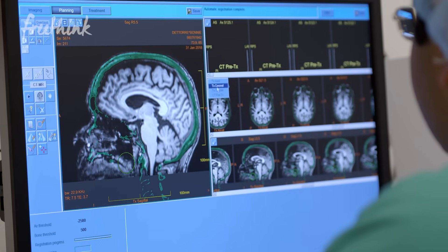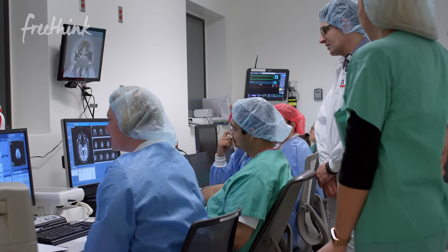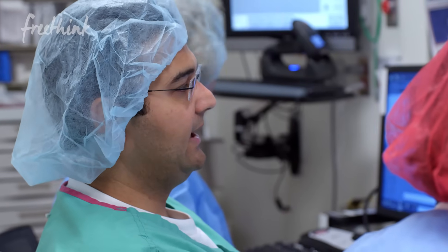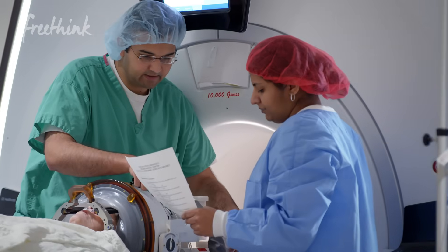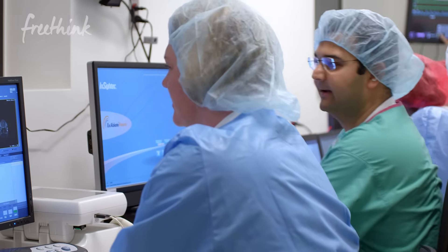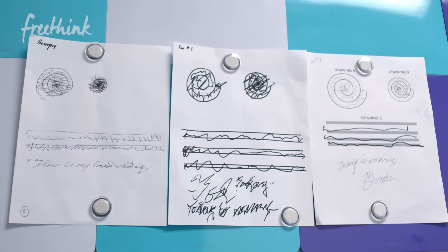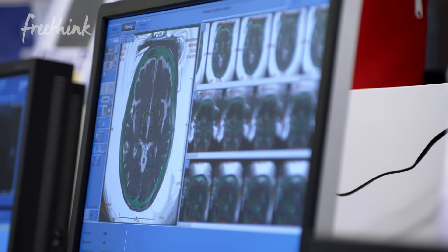We have low power, low energy ultrasounds getting to this target so that we can test and see how Bonnie is doing, how her tremor is doing, and if she's having any side effects. The surgeon has to be very careful because a small move in the wrong direction can really have significant implications for a patient's life. Once we were satisfied that the target in the brain was giving her tremor relief, we increased the energy slowly.